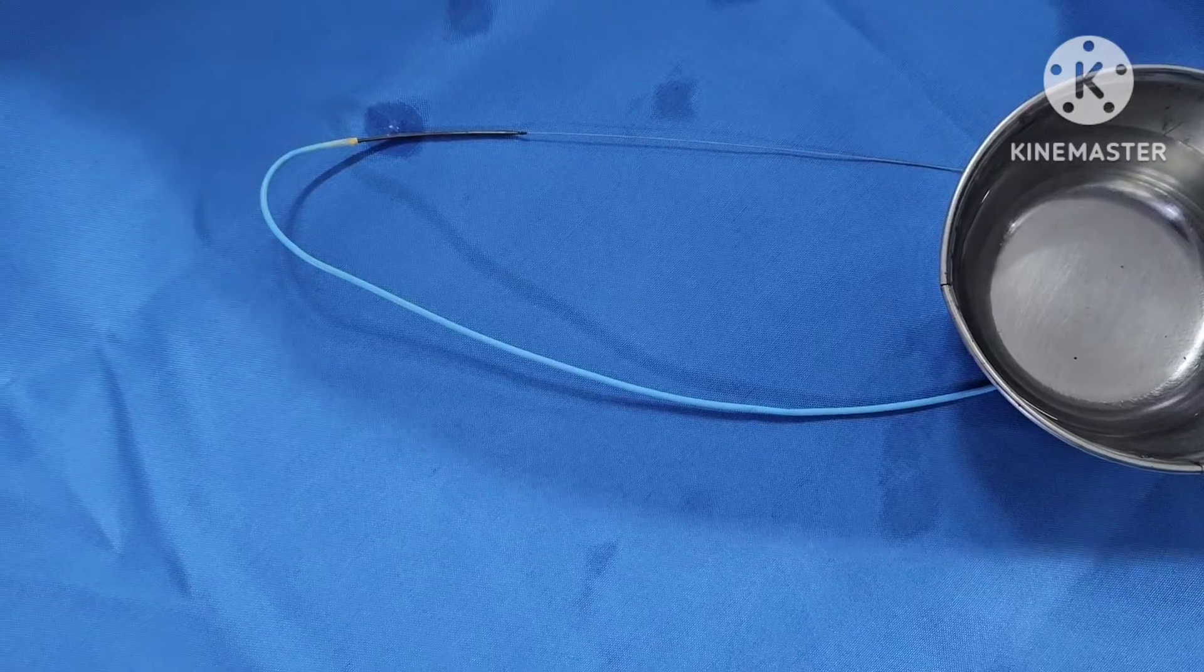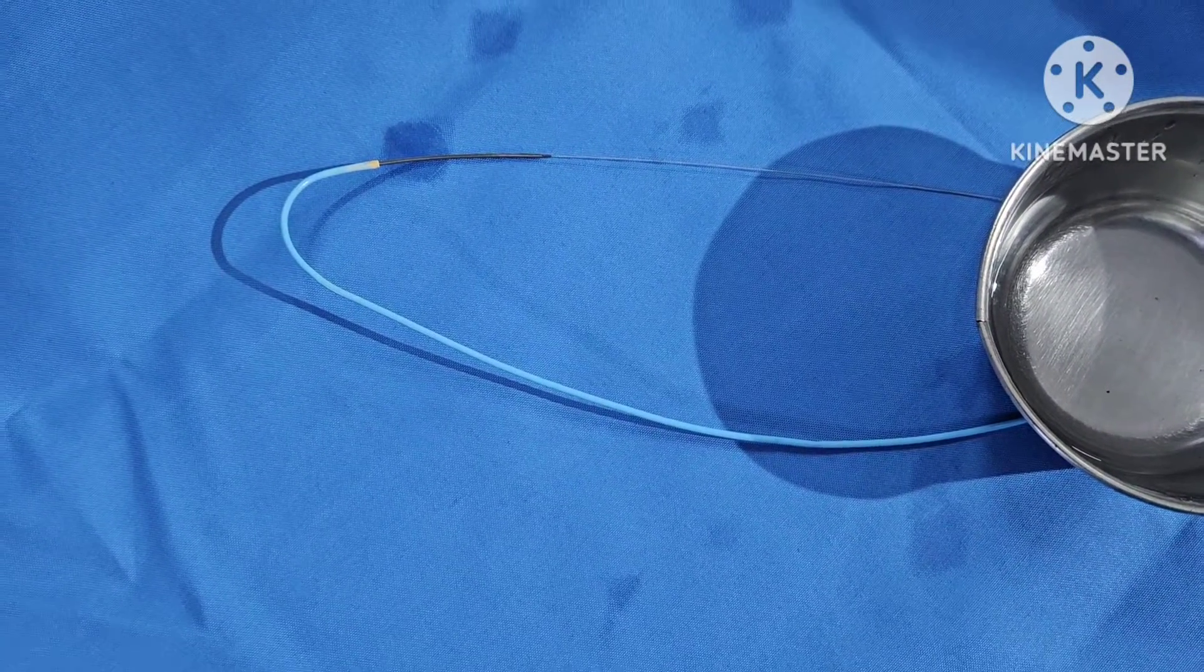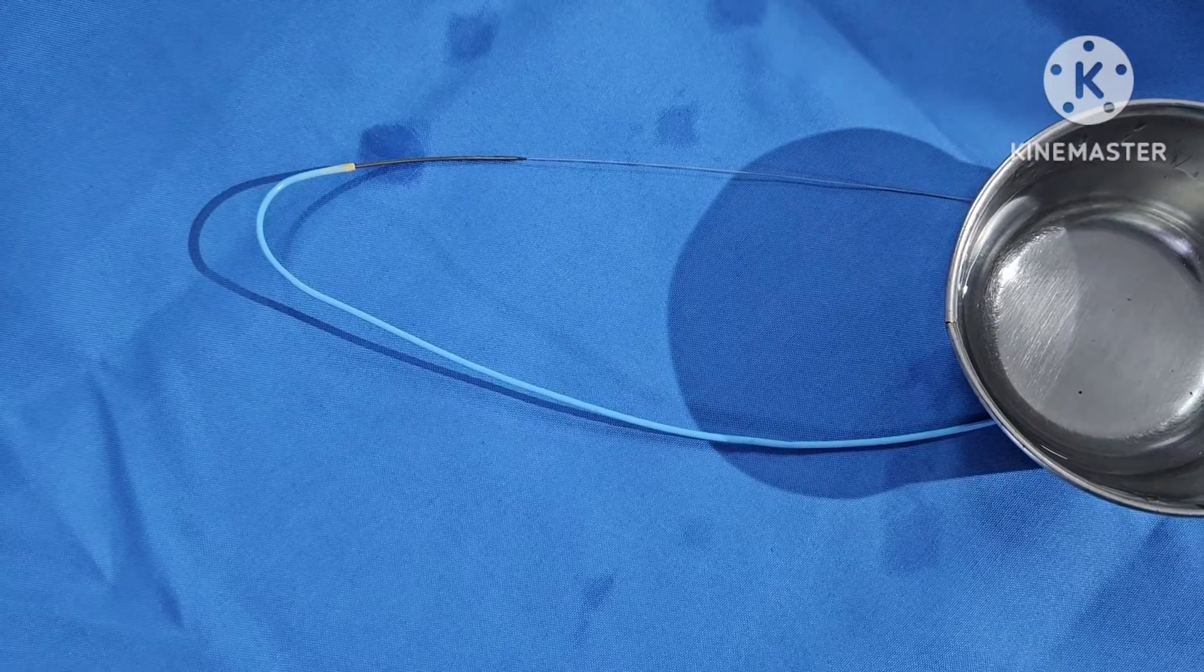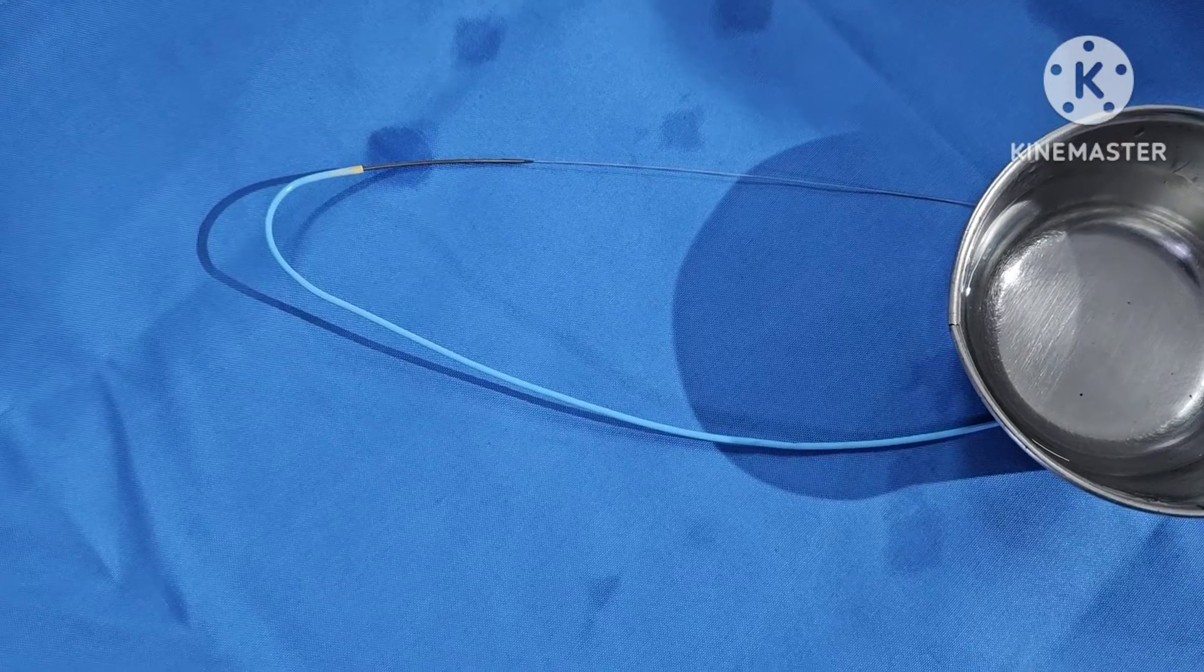And it will be placed proximal to the, just proximal to the lesion that we want to aspirate, basically a thrombus laden or thrombus high thrombus burden lesion.